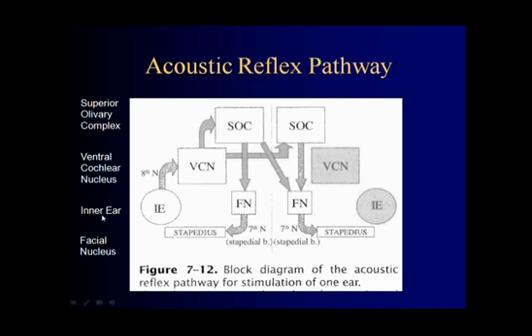And we can see this by putting the probe tone in this ear and putting something called a reflex eliciting tone in the ear at the same time. So imagine the 226 hertz probe tone, and then we have another tone that's the reflex eliciting tone, presented at a relatively high level, can elicit this response, and that will cause a change in admittance or a change in the flow of energy.